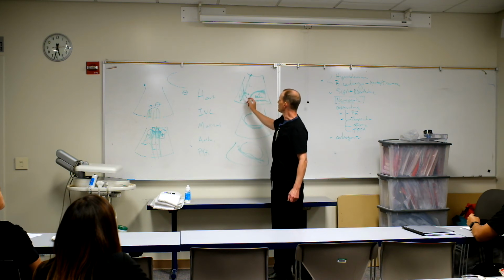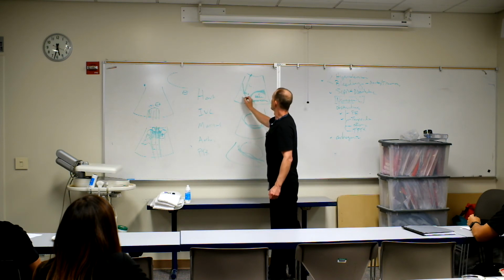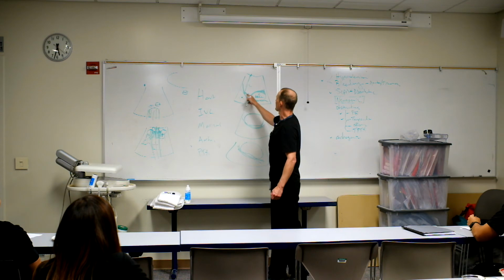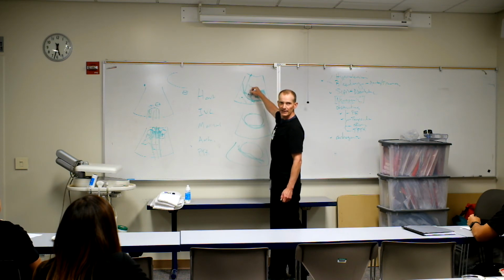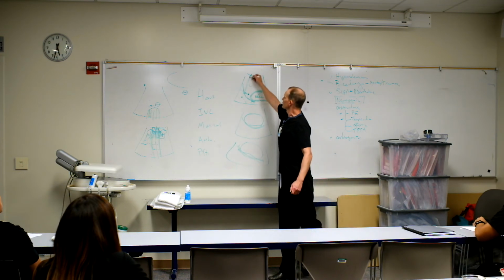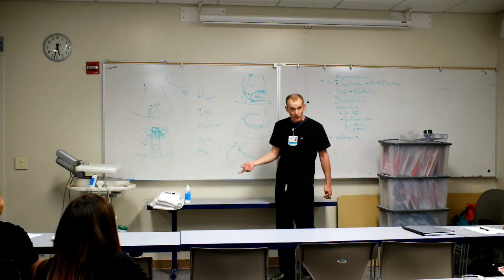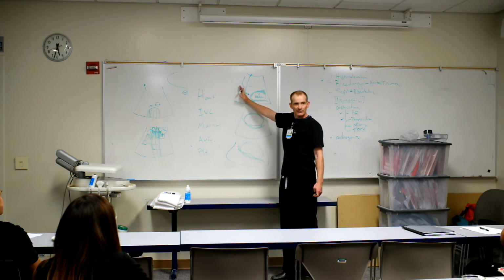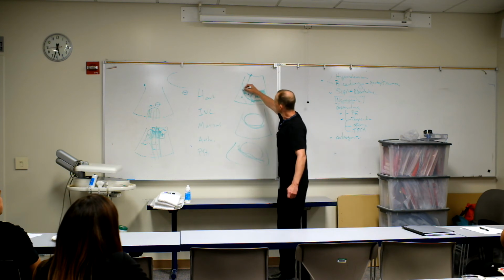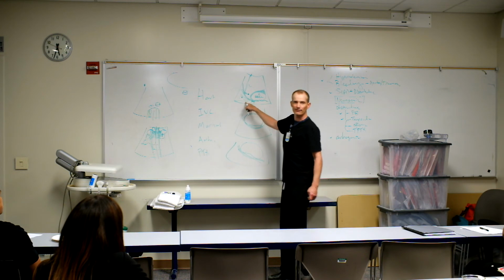So what it does is it will put a mirror image about 90 degrees off here from where it is. Let's say you hit a portal vein or a hepatic vein or something here, it'll show up over here. And it's just an artifact of this little bounce and reflection because it thinks that it went like this. Okay? Now, if you have a big effusion, suddenly we don't have air here anymore. We've got fluid. So you'll see maybe a black stripe here, but this spine will come out underneath that diaphragm.